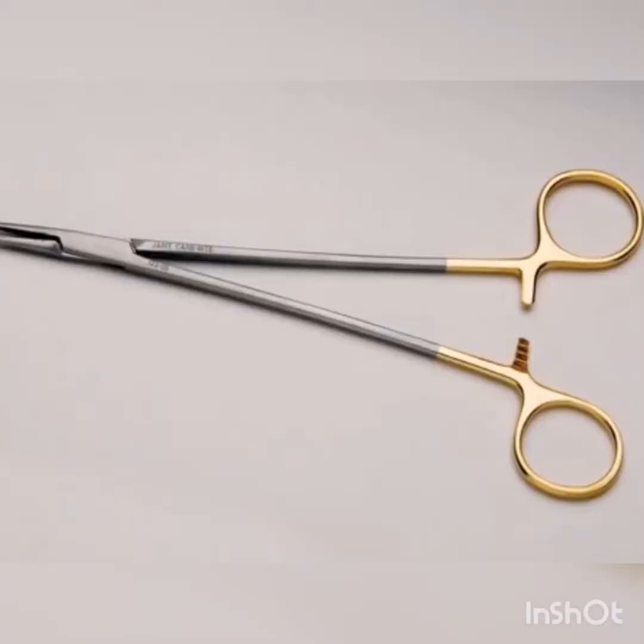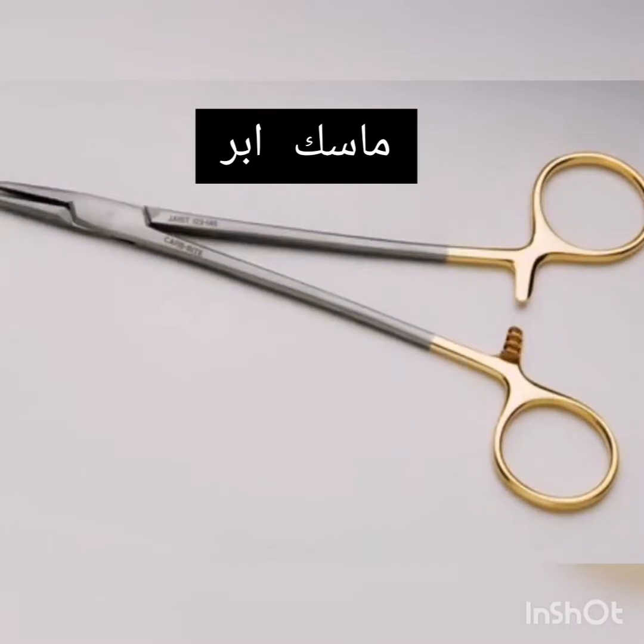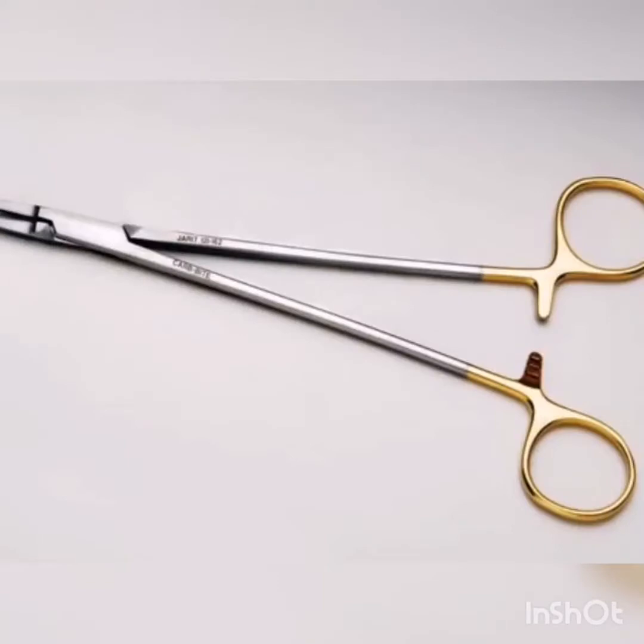Crile-Wood Needle Holder. Mayo-Hegar Needle Holder. Ryder Needle Holder.